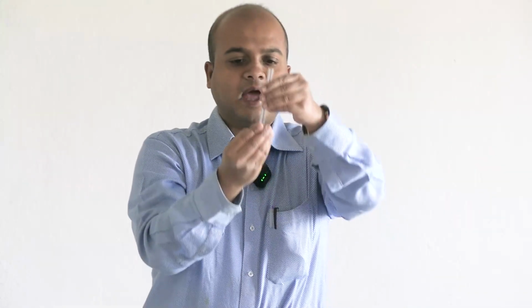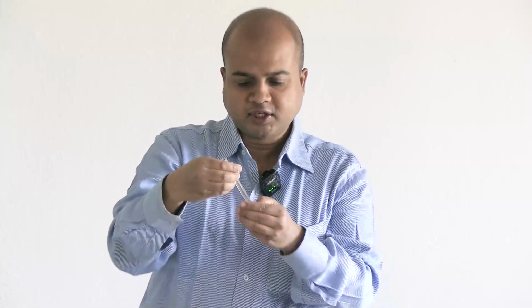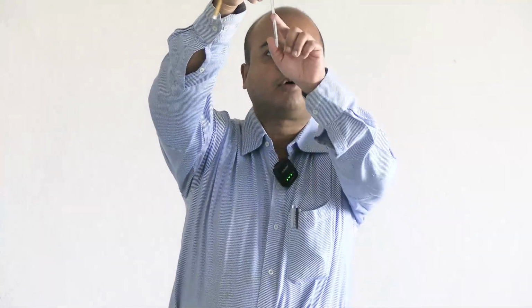After taking acid up to the 2 gram percent mark, there is no 2% mark, it starts from 20%. That is only percentage, which we do not need. The 2 gram percent mark is usually yellowish, but you will go by 2, 4, 6, this level, this graduation, even if it is some other color. So the color is not important, just the 2 gram percent mark. Taking acid up to the 2 gram percent mark, we put it in this hemoglobin comparator box, and then we suck 20 microliter blood, up to the 20 microliter mark.